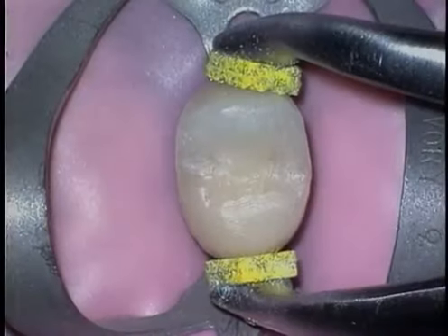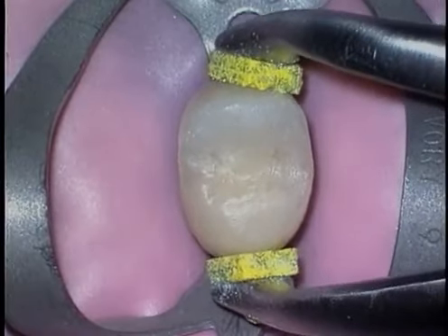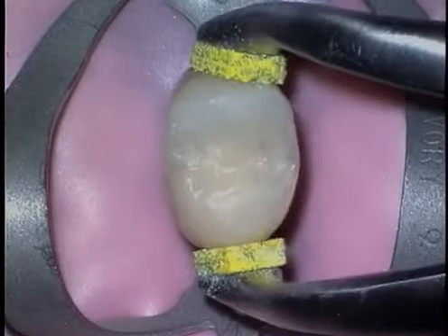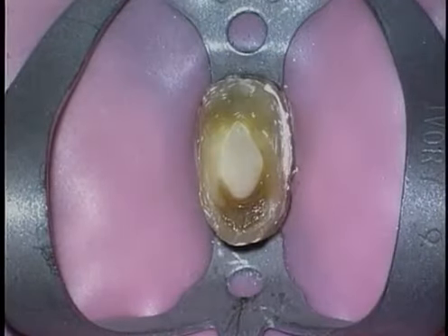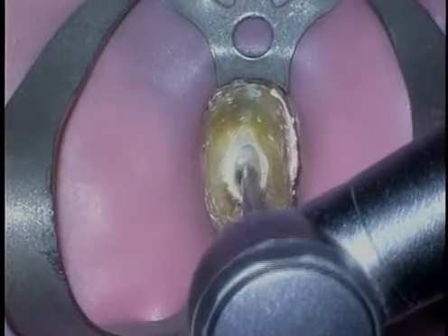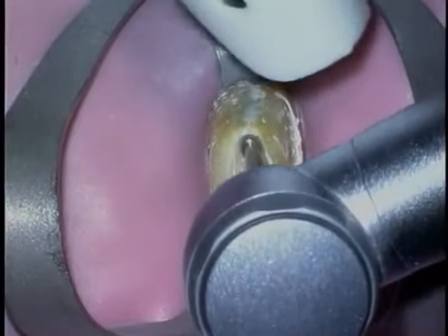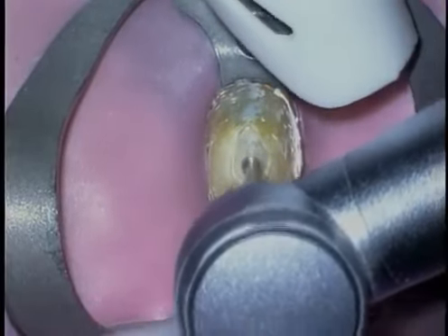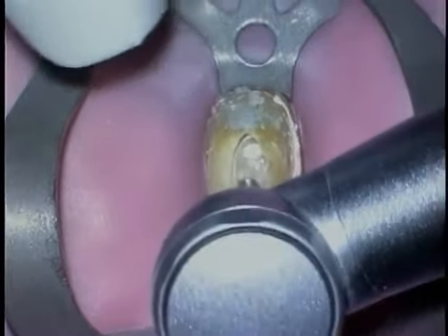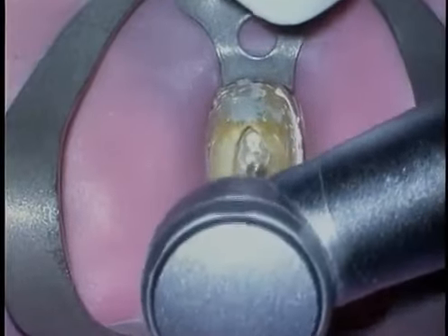Again, it's always wise to try to get a crown off a tooth to enhance vision. The KY pliers with their rubber pads and emery stone give us a strong purchase so that we don't dangerously slip off the tooth. Try to isolate your teeth as close to the free gingival margin as possible. This exposes as much tooth structure as possible so you can get a better read on the anatomy of the clinical crown.